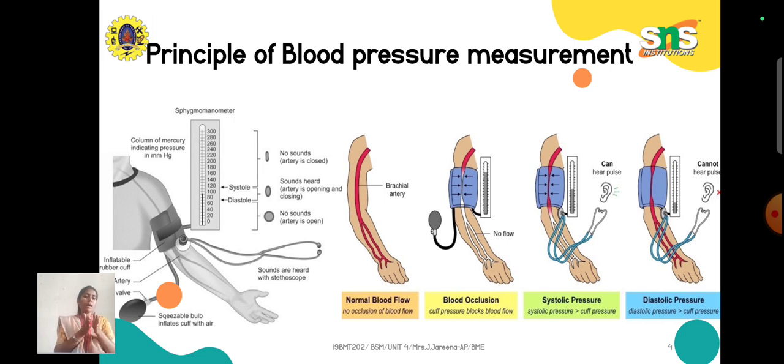In the second stage, when you are releasing the pressure, the blood is finding a way, some minimal path, and it is trying to escape from that area. So it flows in an abnormal way, following zigzag directions. In that case it will hit the blood vessels very hard, so it will make the blood vessels vibrate. That is the reason we will start to hear a sound.